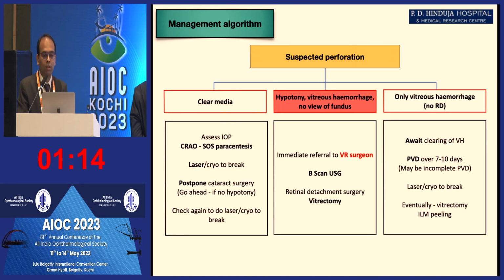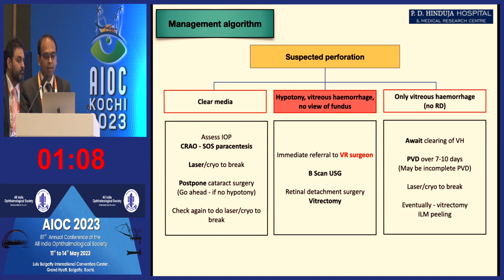And what to do? In a clear media, you can assess the IOP and do a paracentesis to prevent a CRAO. Laser to the retinal break can be done immediately. You can postpone the cataract surgery. However, there is still a debate: if the glow is fine, you can go ahead with the cataract surgery.